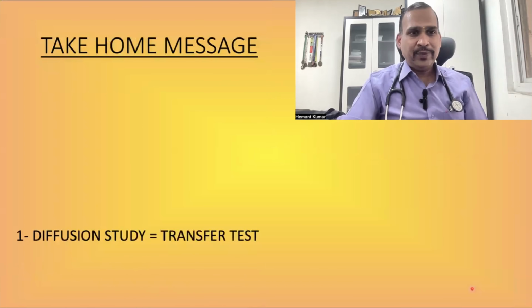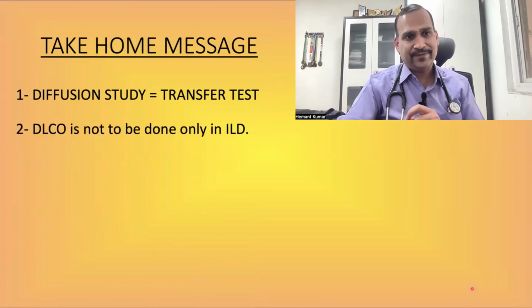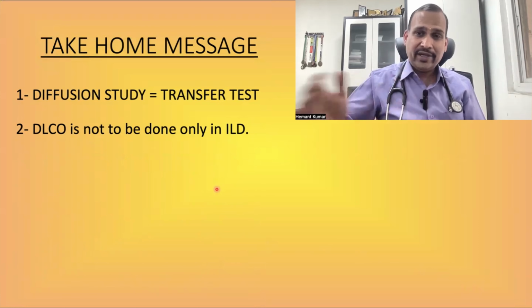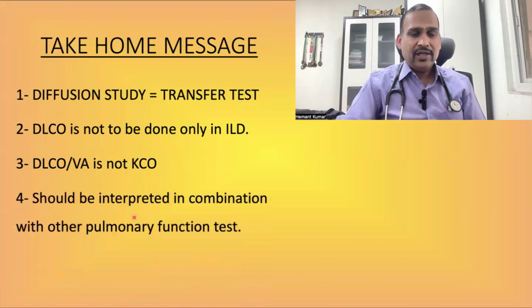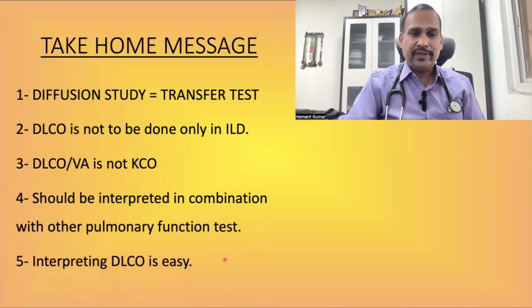So the take home message: diffusion study and transfer test are both the same. The correct term is transfer test. DLCO is not only to be used for ILD, but we have to do DLCO in other conditions like to diagnose early emphysema, drug-induced ILD, drug monitoring, and other indications. DLCO by VA is not KCO. Both are related but not the same. It should be interpreted in combination with other pulmonary function tests like spirometry and total lung capacity to diagnose the patient fully.